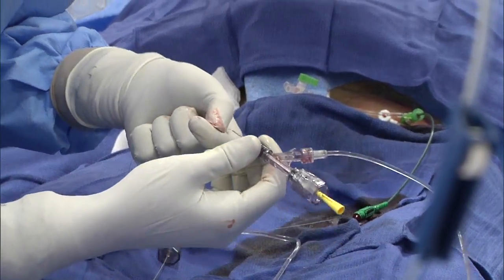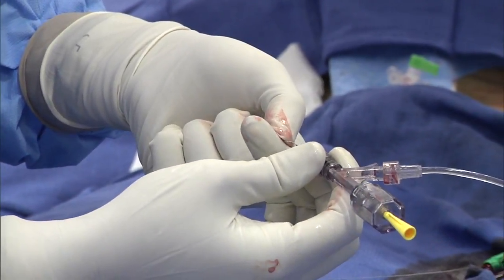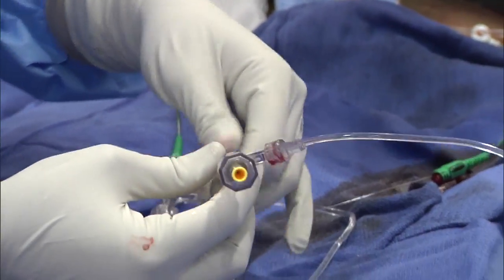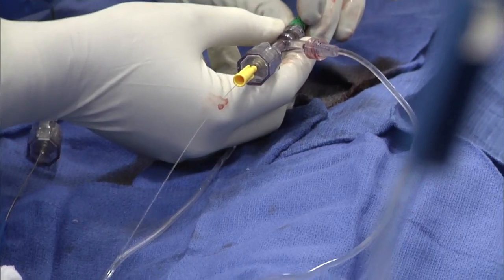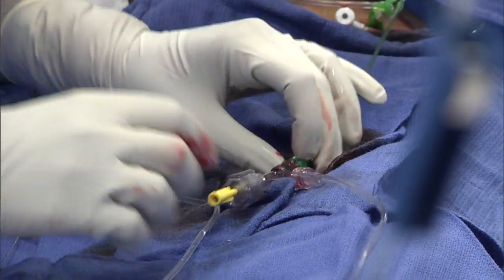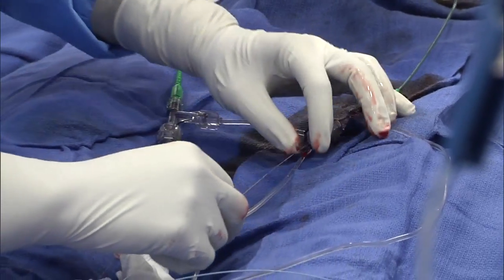So this is another point where you go through this wire introducer the other way. See there? Come out. So the wire truly has come out without any trouble. Connect it. Take your wire. 220 compliant balloon. So now we are good to go.